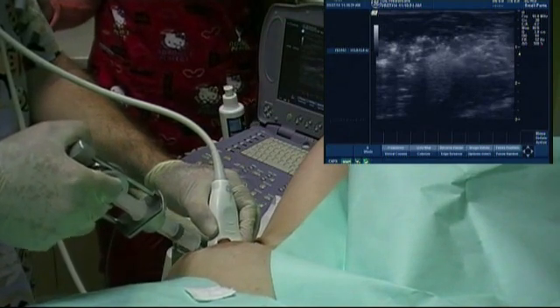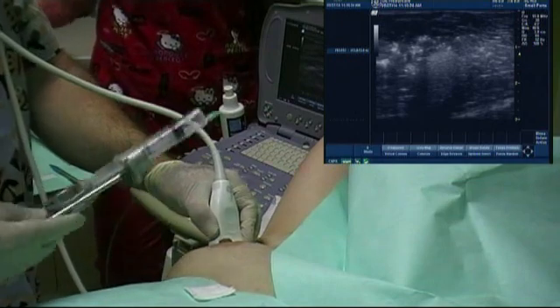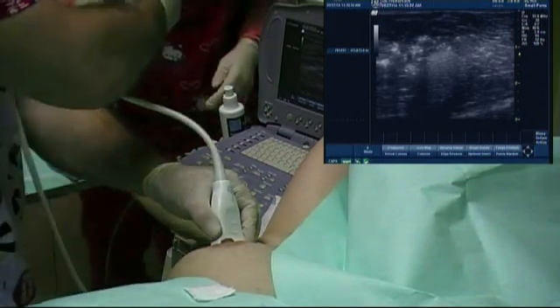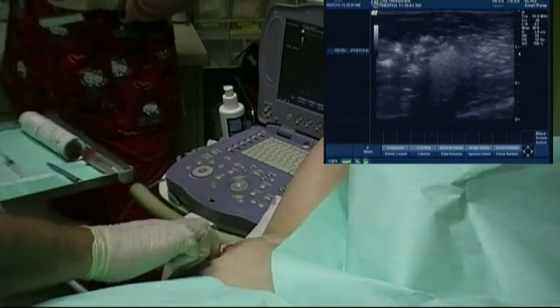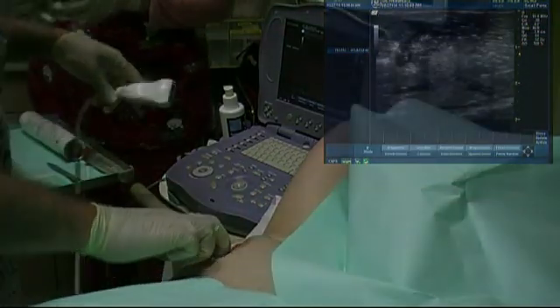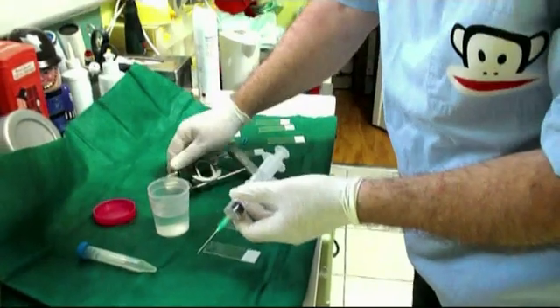We save the procedure in images with the needle in the lesion, pre and post needle passage. We prefer to save the procedure in a video which documents the accuracy of the positioning. Once we have enough sampling in our hub, we remove the needle from the breast without suction.